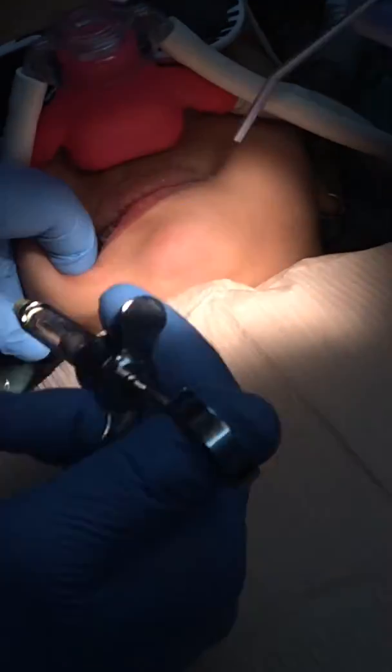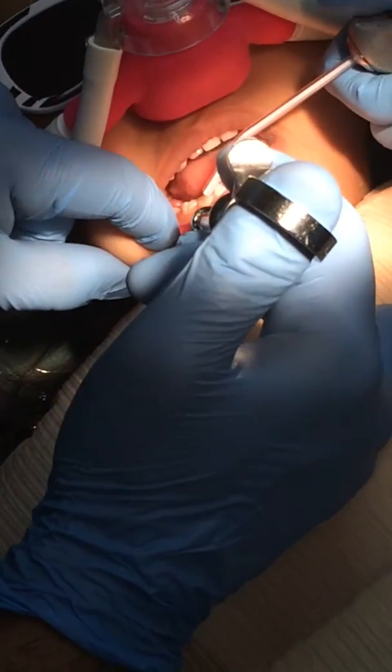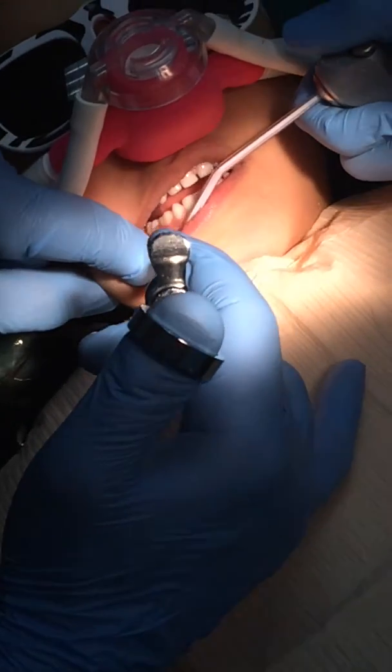Now we do the bottom. Again — bite down, bite down tight, that's it. We just have to actually close. Can you show me your lips? Like that, good job. Look at me, like this — can you do that? Good job.